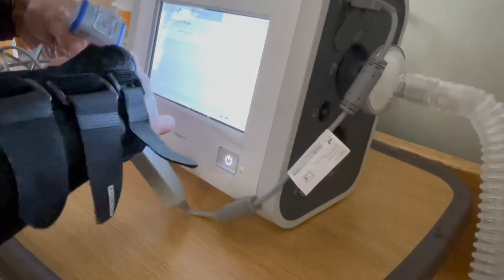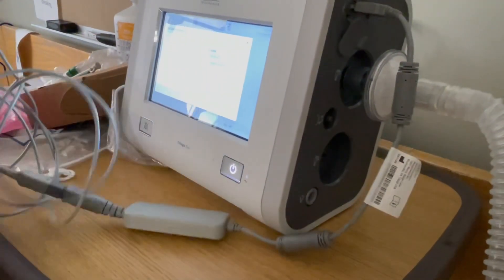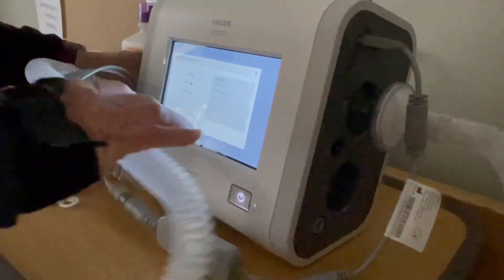Disconnect. There we go. But I don't think you need to test every time you turn on the button.